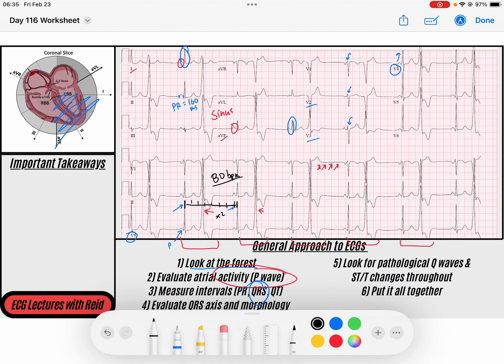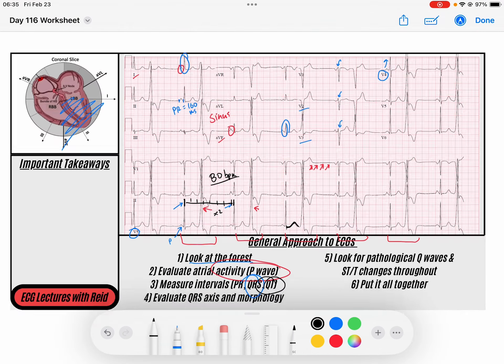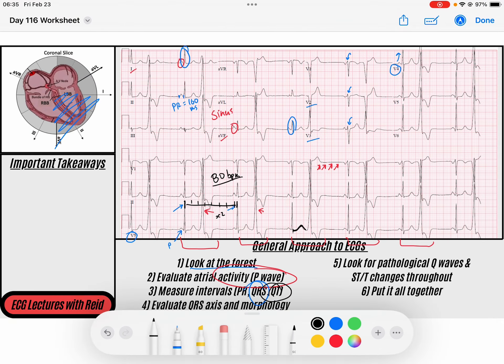I look at the QT interval and it looks appropriate. The T wave does not seem very slurry or long. Scanning for pathological Q waves or ST and T wave changes that would suggest ischemia — we think of premature beats sometimes being triggered by an angry myocardium — I scan through the anatomical leads and I don't see any. So all clear.